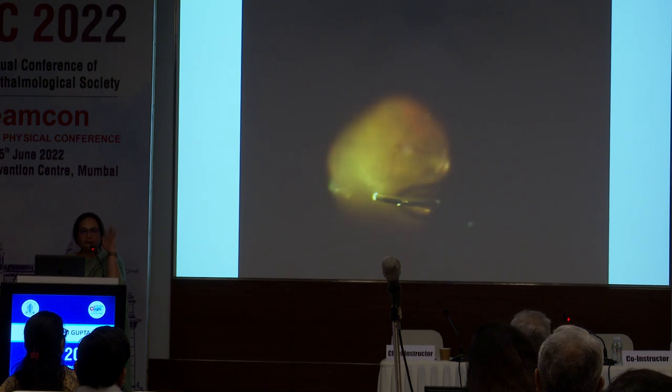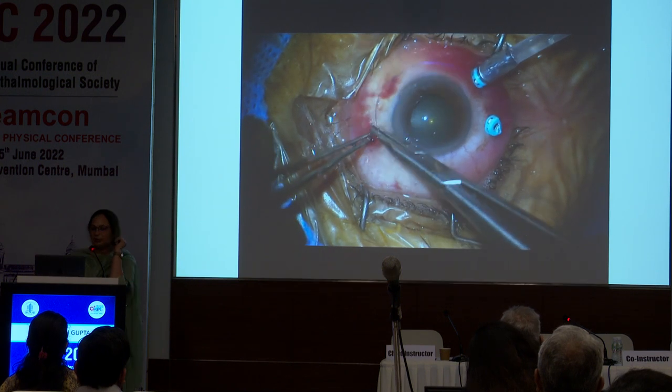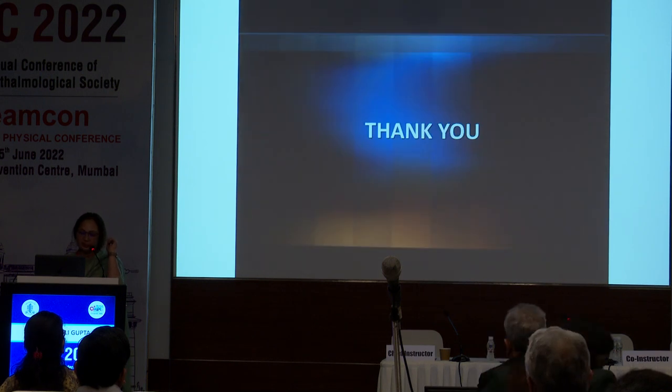And if I'm doing it, I put it too. This is the clear vitreous. This is out of context, but I learned the hard way: always suture these uveitis patients. No ego here.